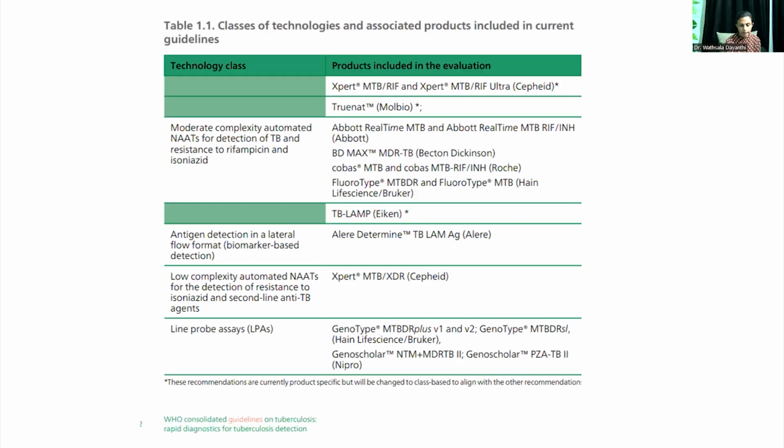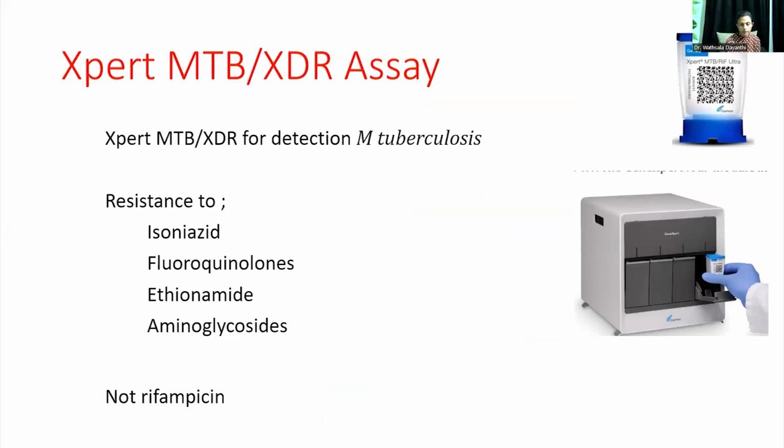As I said, it's just like a summary. The first two tests we have in Sri Lanka are GeneXpert and TrueNat. Then again, we have the Xpert XDR and the line probe assay, which I will discuss in the next slide. This is only available at NTRL at the moment.